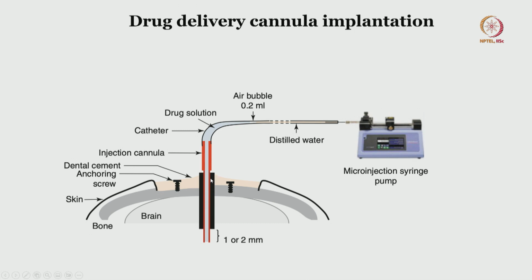once the stereotactic apparatus is out, you can use this particular cannula anytime without the stereotactic setup by using the guide tube, which is going to maintain the coordinates that you have used, and this guide tube has been fixed rigidly to the skull using the dental cement and the screws. And this is the idea even for the optogenetic cannula we just discussed, and for that matter microelectrode implantation.